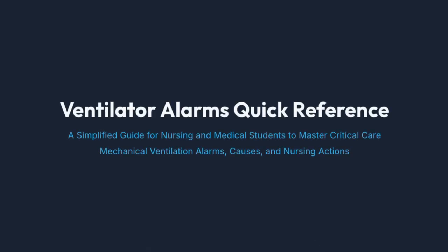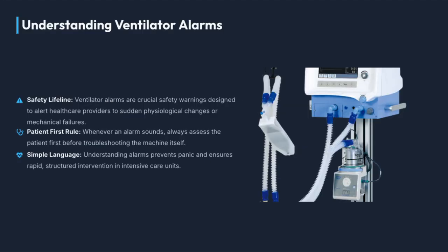Welcome to this video on ventilator alarms, a simplified guide for nursing and medical students to master critical care mechanical ventilation alarms, their causes, and appropriate nursing actions. Ventilator alarms are crucial safety warnings. Remember the patient first rule: always assess the patient before troubleshooting the machine. Understanding these alarms helps ensure rapid, structured intervention.